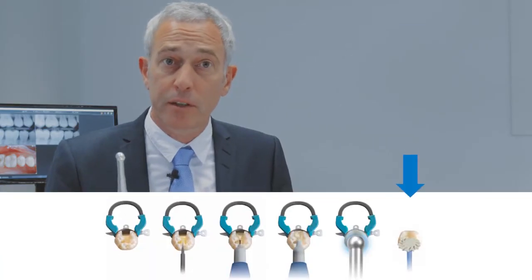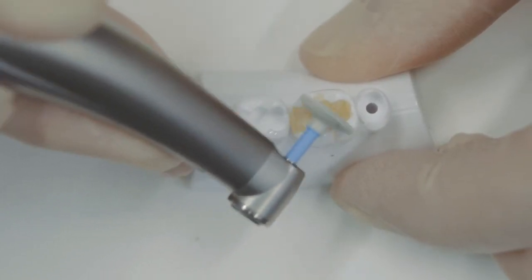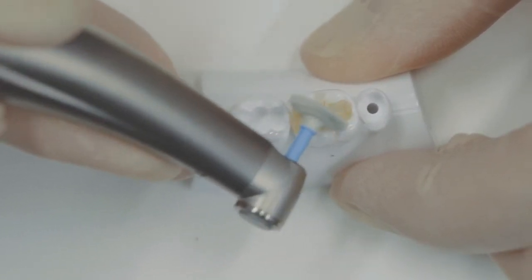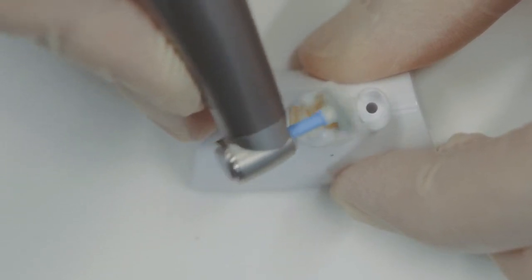After final light curing, the last step in the procedure is the polish. Due to the SphereTech filler technology in CeramX, a high luster can be achieved in just a few seconds using the polishing system CeramX Gloss. A smooth restoration surface is more resistant to staining and bacterial accumulation, which increases the longevity of the restoration.